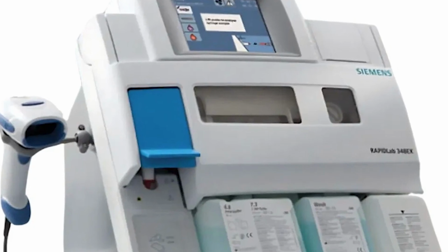Now this isn't true for every single machine in the hospital, every analyzer. It is for a lot of them, but certainly it is true for an ABG machine, an arterial blood gas analyzer, that the federal regulations typically require that be proven to be accurate at least about once a shift. Now, it is kind of sketchy here and there, so it's usually done about every 8 hours. Technically, you could do it every 12 hours, so it can be done just twice a day. A lot of labs will go ahead and do it 3 times a day because of this.